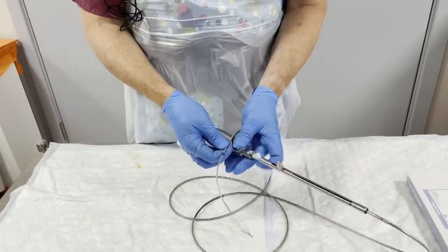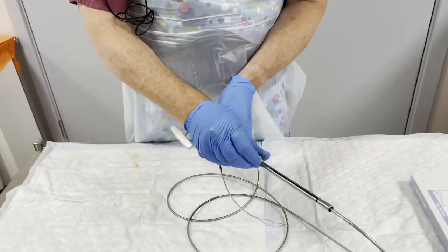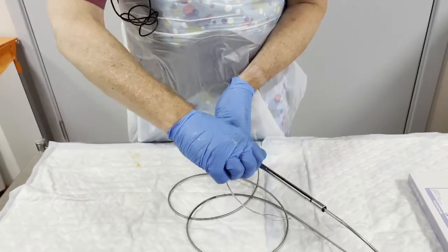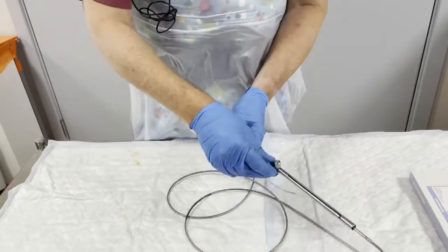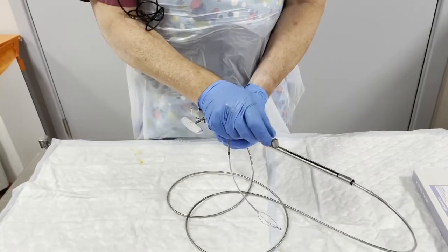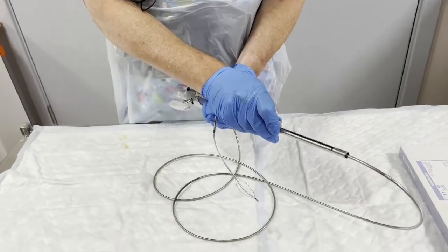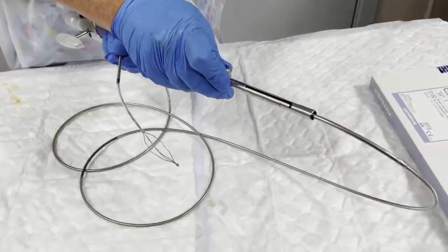It is the metal sheath that we see here that crushes the stone. So we need to advance this metal sheath, and we do this by releasing gently this cap, not too much otherwise it comes off in your hand, although you can re-secure it. And then we advance this sheath.